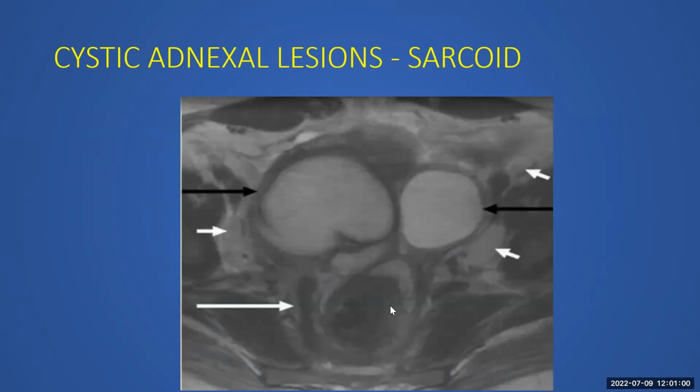So to summarize, sarcoidosis is a really interesting entity. You have classical descriptions on CT and chest X-ray, but because it's got a lot of atypical presentations, sarcoidosis would come in a lot of differentials wherever. Firstly, you get lymph nodal enlargement. Secondly, lung lesions, especially where you see small nodular lesions. And thirdly, bone lesions. So just remember that. That would be your take-home message.